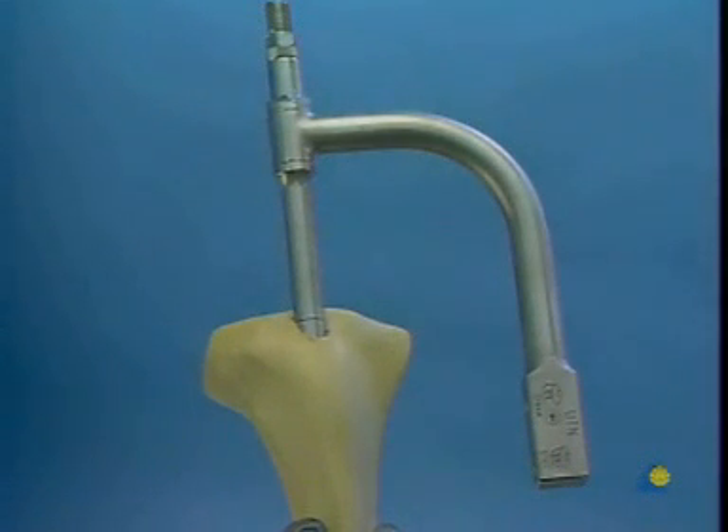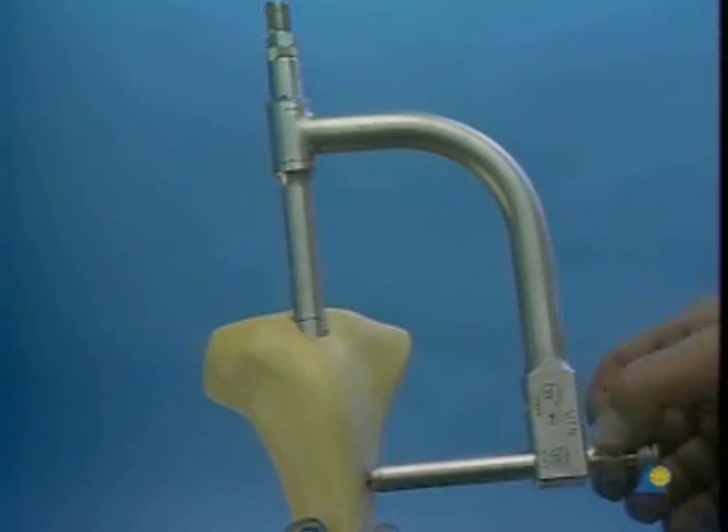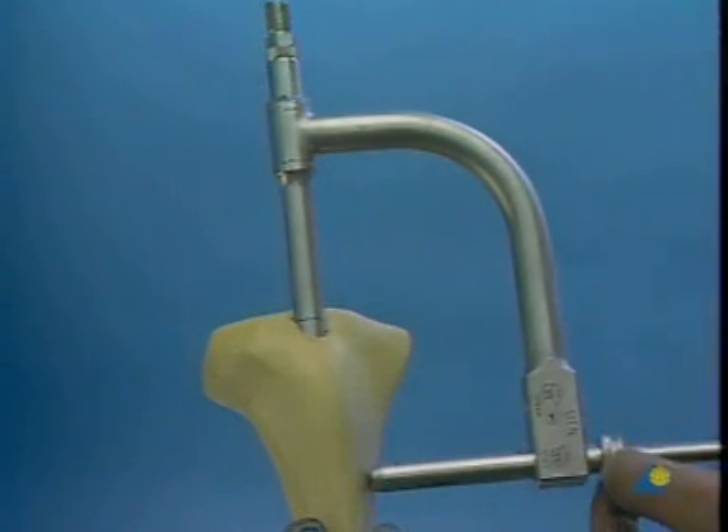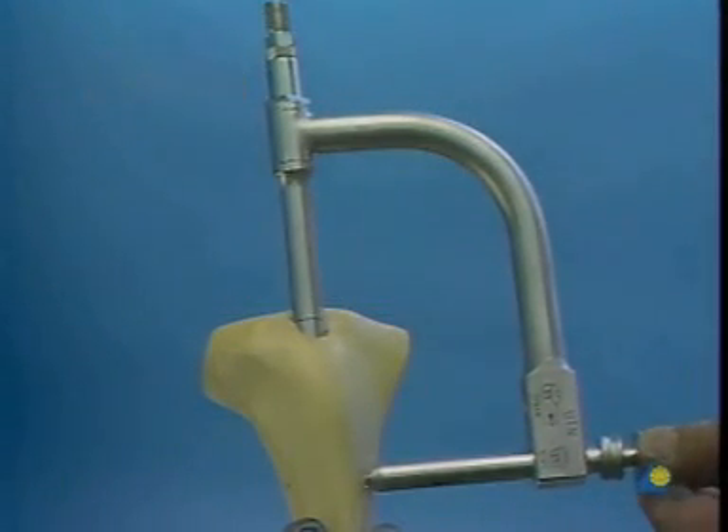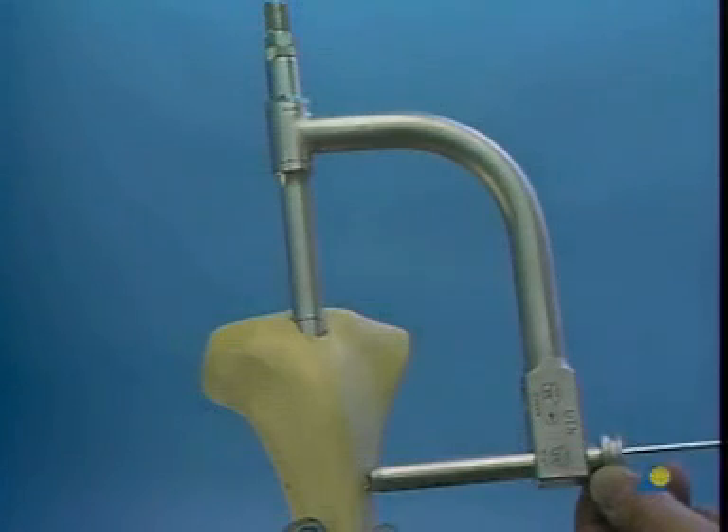The tissue protector with the inserted trocar is passed through the hole marked STAT on the insertion handle and down onto the bone. The trocar is removed and replaced by the 3.2 millimeter drill sleeve. We drill a 3.2 millimeter hole through both cortices, then measure the required length of the bolt through the tissue protector.